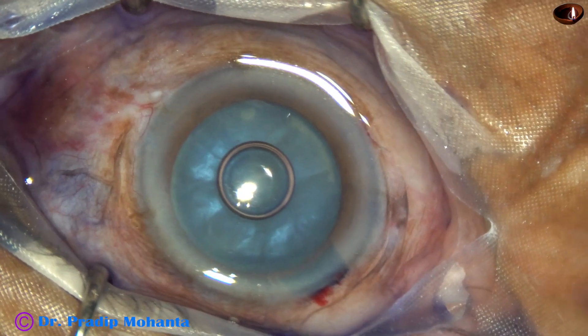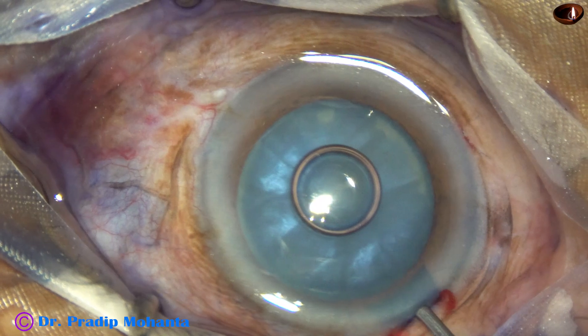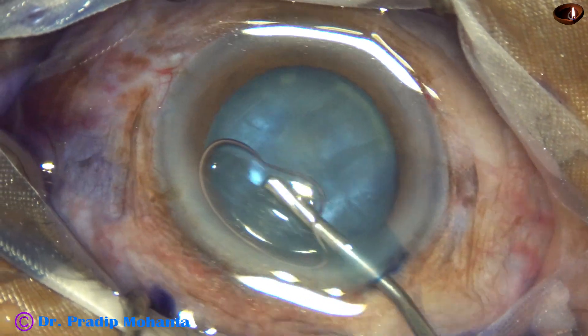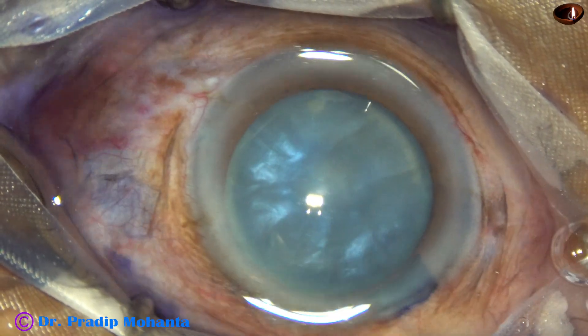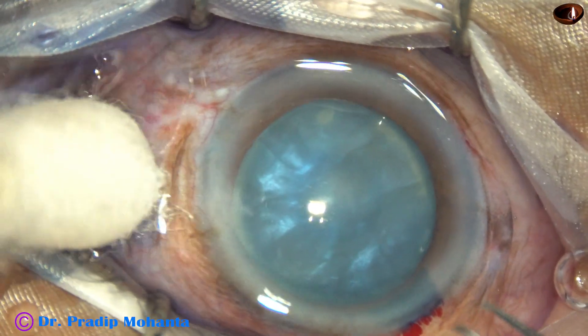And now the anterior chamber is filled up with 2% hydroxypropylmethylcellulose. And now is the main step — doing the capsulorhexis.